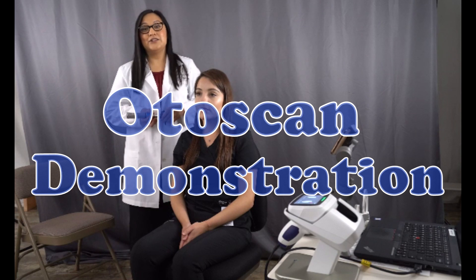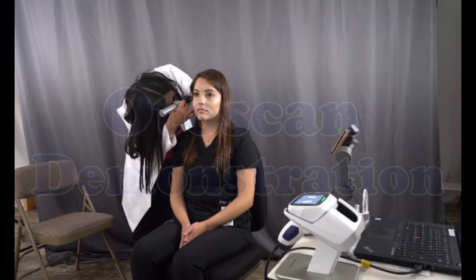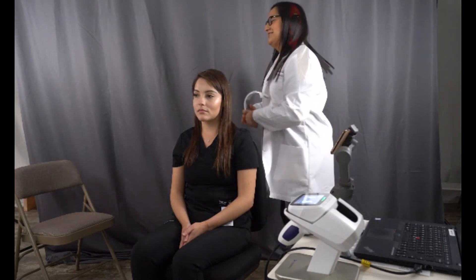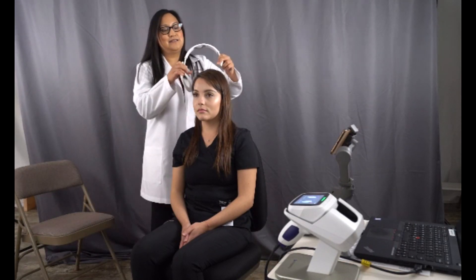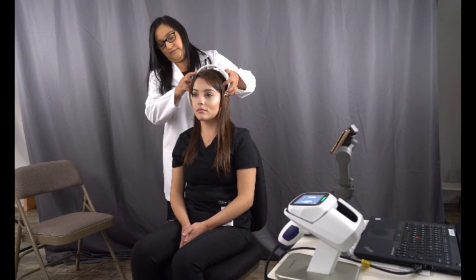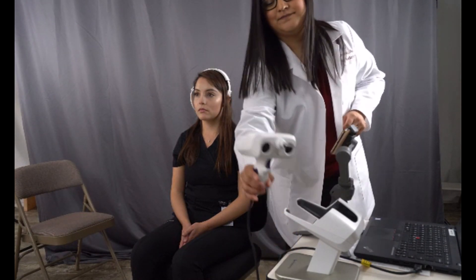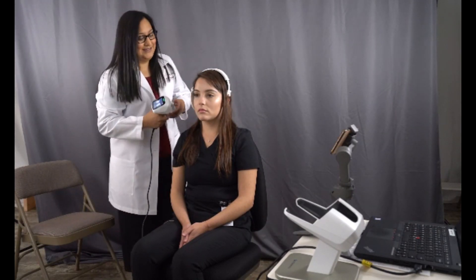I'm going to ensure that the ear canal is free from wax. I'm going to take a look at my patient's ear. Clear from wax. I'm going to place the headband on my patient's head. It's going to be secure and tight, but it should not be uncomfortable. And now we begin the scan.